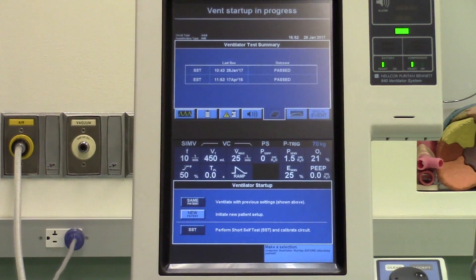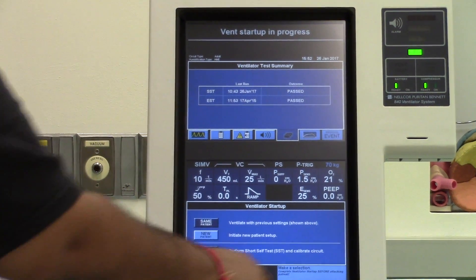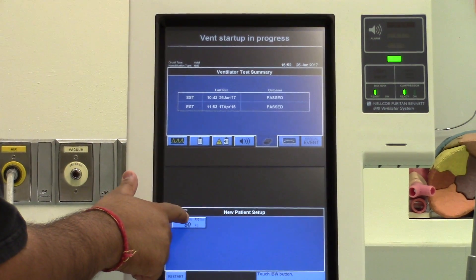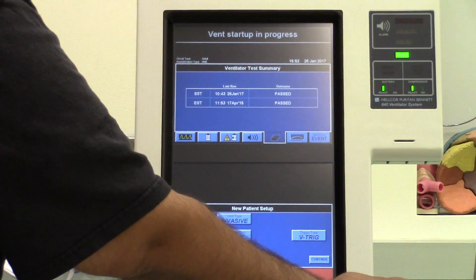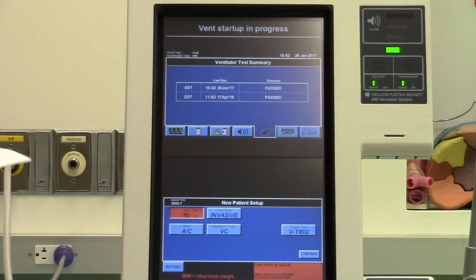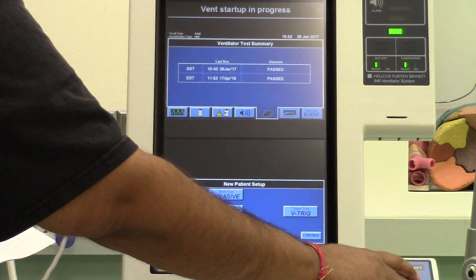The ventilator lets you know what to do next by giving you prompts in the lower right-hand corner of the screen. Select new patient setup by touching the screen. If a patient at the hospital is being placed back on the ventilator, you would choose same patient. Enter the ideal body weight: first touch the IBW button — it turns to the color of sand, indicating the ventilator is waiting for a change. Turn the wheel located on the front right of the ventilator and enter 70 kilograms, which is an average ideal body weight for adults.